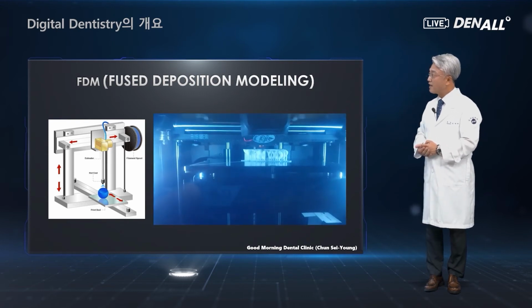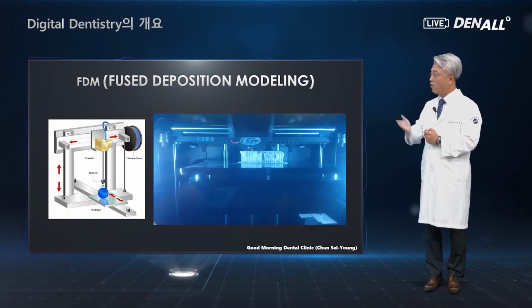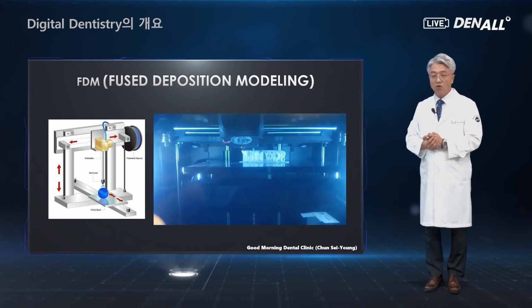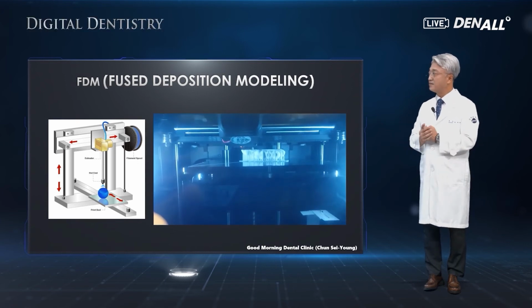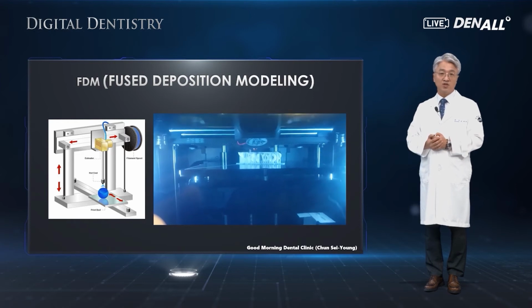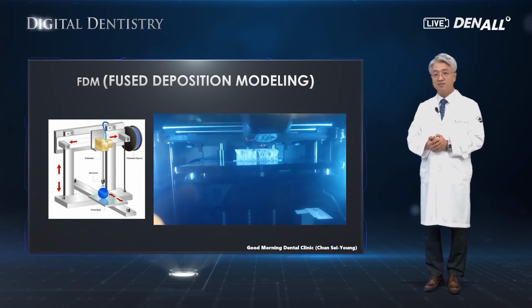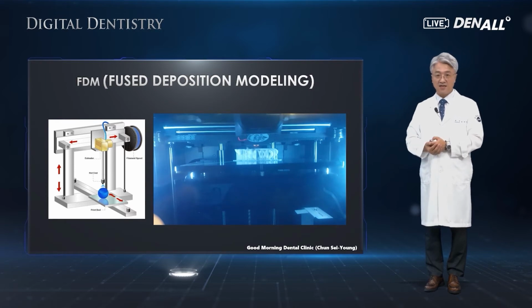Actually, the one guide is printed with the FDM method. The precision is quite excellent. Various toys or low-priced products can be printed in the industry or at home. And this system is something we need to take a note.